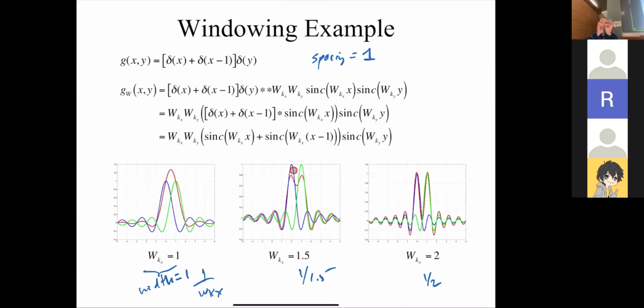All right, so it's showing the farther I go out in K space, that means if 2 dots are spaced closely together, I'll be able to see them better. And if I go out even farther in K space, now I'm convolving each of those delta functions with a narrower sinc. So you can see here, each of these sincs is narrower. And so when I look at the sum, I can very easily resolve these 2 dots. Okay, so this is just telling you why the width of the sinc function is related to resolution, which is your ability to resolve objects that are close together. All right.